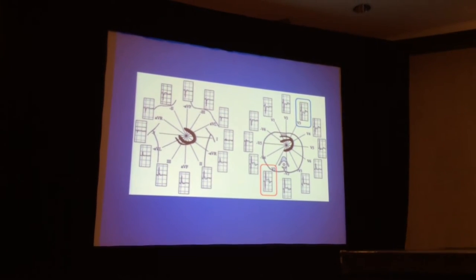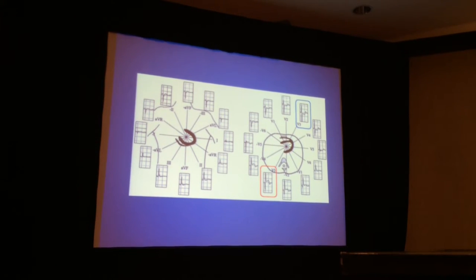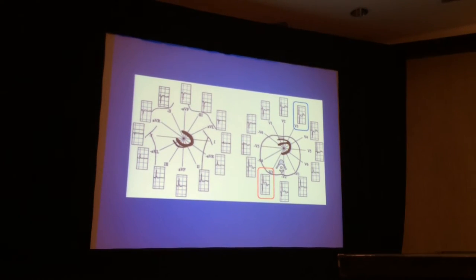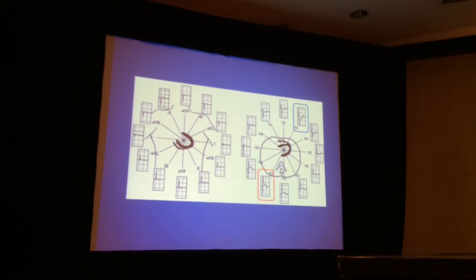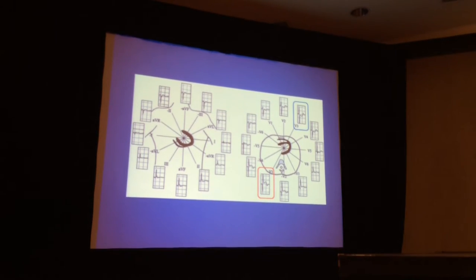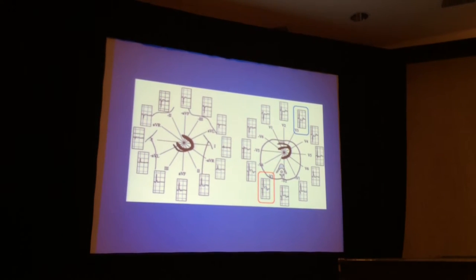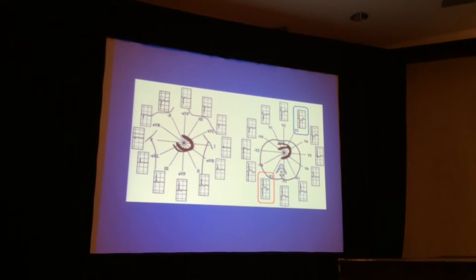so there's license, and we're not arguing that in fact there are 30 degrees between each of these, but again, we're looking with the heart in the middle and showing how we really do have a total of 24 views. In this particular individual, the question comes, is this a patient with chest pain, and does this patient have, indeed, ST elevation infarction? Well, you can see there's no significant ST deviation at all in the frontal plane. But in the transverse plane, you see depression in V1, V2, V3, V4, and people would say, well, this is anterior subendocardial ischemia, or something of that sort.